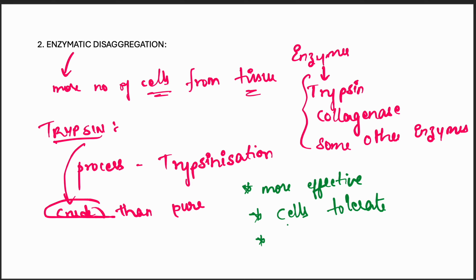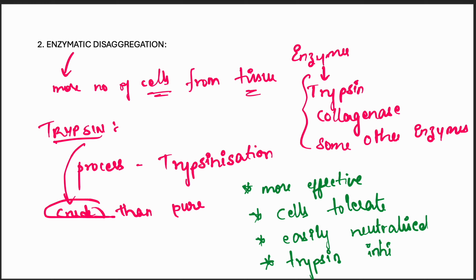Next, it can be easily neutralized in serum. If serum free media is used, trypsin inhibitor is used.